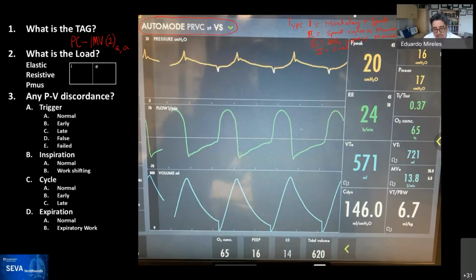When you reach that amount of time of apnea, then it starts triggering the mandatory breaths. So it's not necessarily the rate that you set over here, that if the patient breathes under it, it has to do a combination of or some other triggers that have to do with the apnea time that you set on the settings for auto mode.